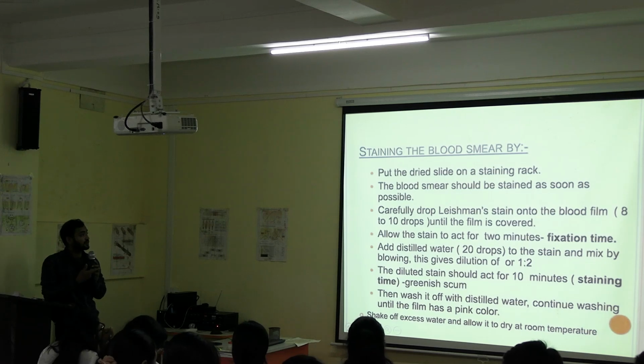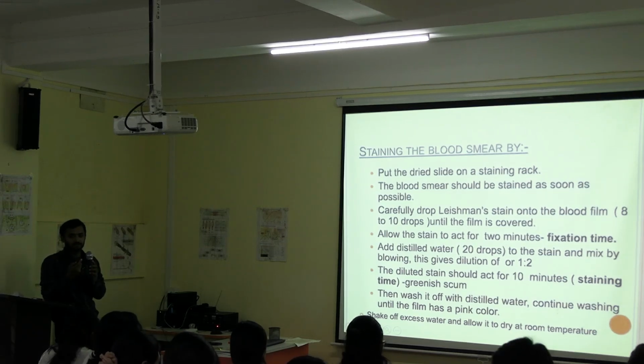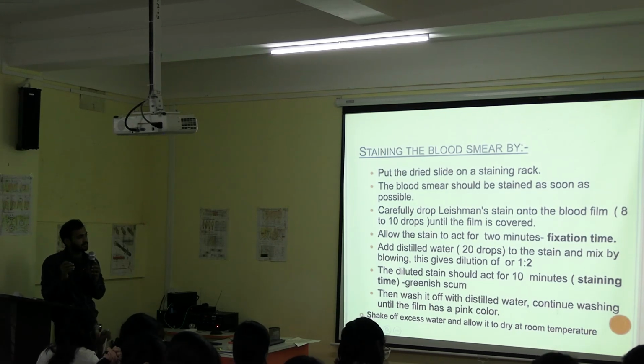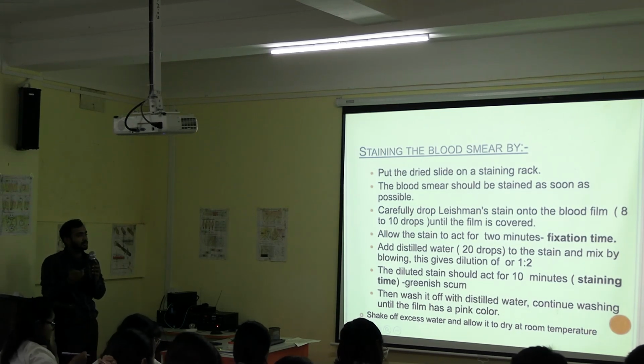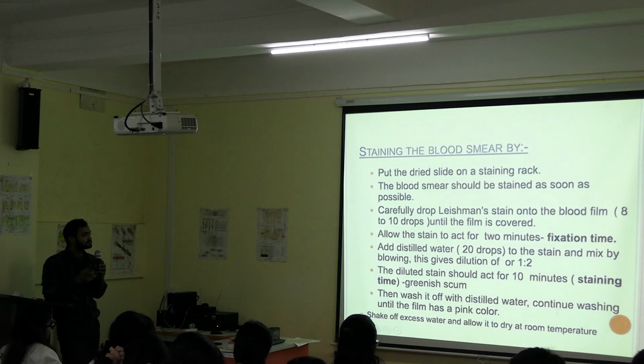This is why we are not using water here. After that you will be using it. If you use water, it won't be fixed, or the blood cells of the smear we have prepared will be washed away, or there will be rouleaux formation.